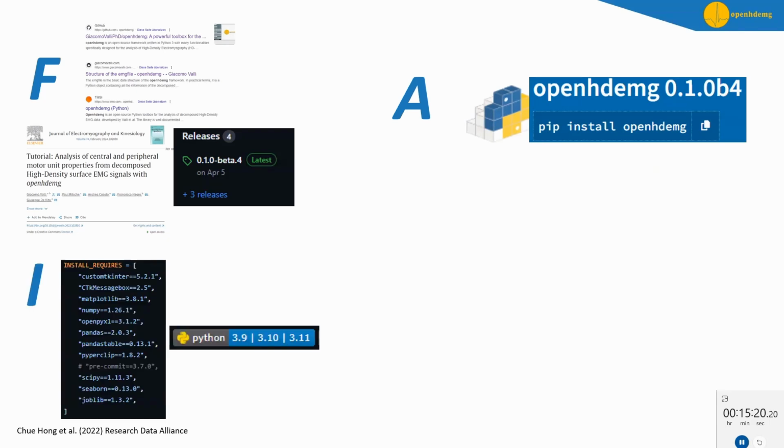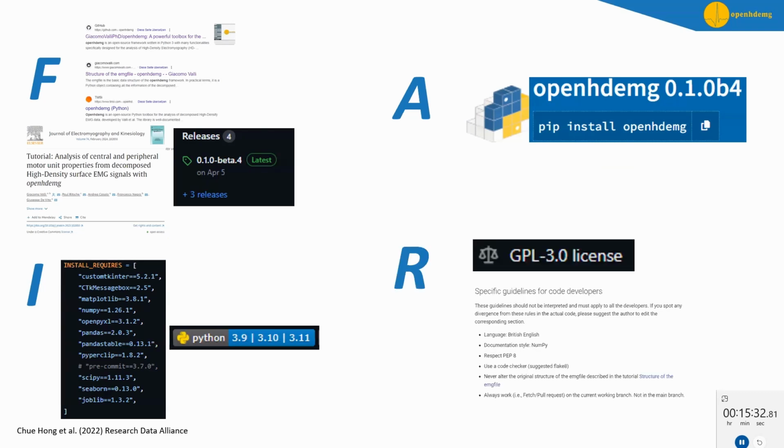Our software is trying to be interoperable in a way that we have tested it on macOS and Windows, so we know it works there. But we also specified the Python versions that it works on, and the other packages that it is compatible with.